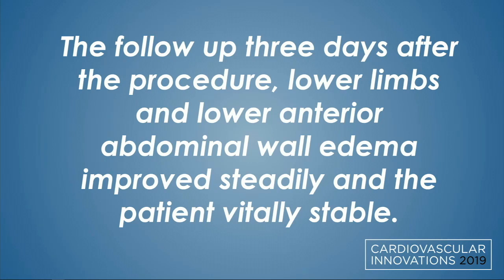Yeah, exactly. Some authors oversize by 1 or 2 millimeter, and some authors don't. In this case, the whole IVC is compressed, so we don't have any idea what the normal diameter of the IVC is. So we roughly estimated, using a 16 millimeter balloon, and then measured the pressure. The pressure went down, and we also got a very good angiographic result. The pressure is a reliable sign for success of the angioplasty.